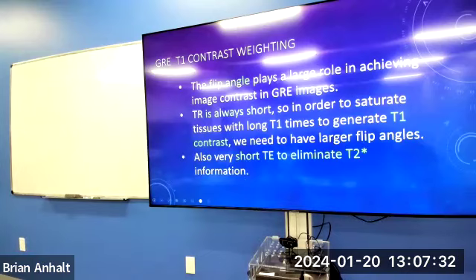So I still have a lot of longitudinal magnetization left. So instead of going from here to 0, we go from here to here. Fat relaxes back quickly, water relaxes back too, and we flip again. So with a small flip angle, we're allowing for full longitudinal recovery even in a short period of time.